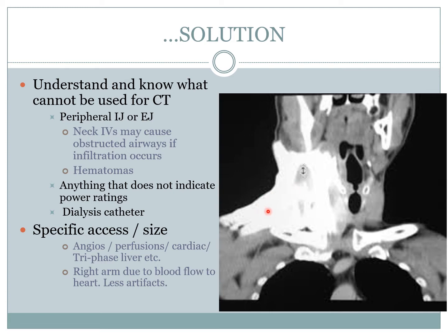Sometimes we can't be there to monitor the IV when the contrast is going, because it's a timed study and we have to look at the imaging outside, and we can't go check, because technically we are supposed to go into the room and check the IV if there is time. So a delayed scan of a routine chest, abdomen, pelvis is about 70 seconds. So you have at least a minute to check the IV. But in this case, if you're doing an angio study, there is no way to check.